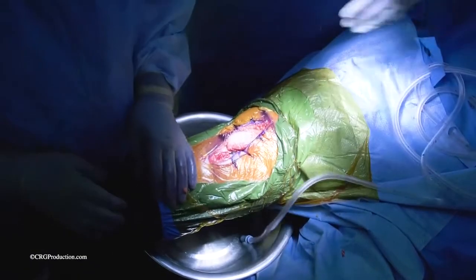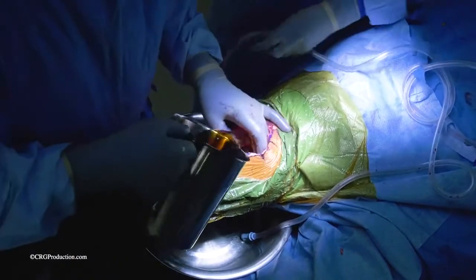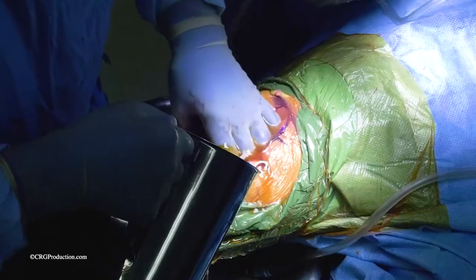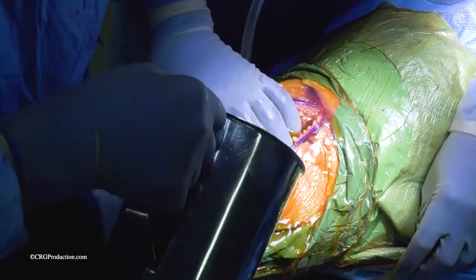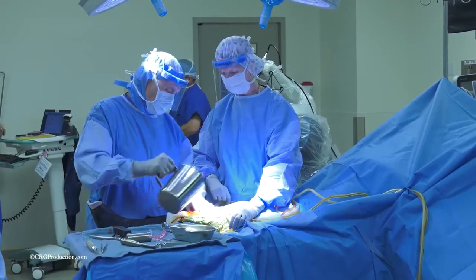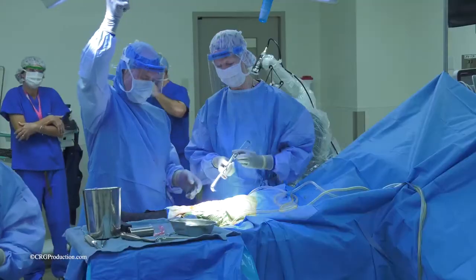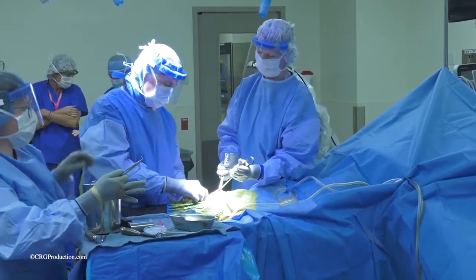So we do have to worry about infection. We have to worry about infection quite a bit. As we noted, we make sure patients are tested for MRSA. We give them appropriate antibiotics before the surgery, within 1 hour of the surgery's time, so that the antibiotic actually circulates through the whole body. At this point right now, we're washing it out with a betadine or iodine solution, and letting this solution sit in the wound. This has been proven to be successful.